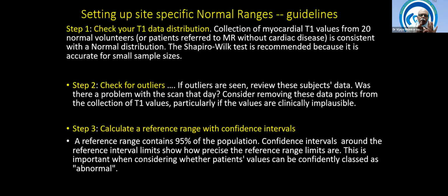How do you do it? There is one interesting article in JCMR in 2019. Good article. It says, first take 20 healthy volunteers who come for a non-cardiac ailment. Measure, whether you want global or segmental, whatever you want. Now, another important point. In healthy volunteers, if you're doing diastole, everyone you do in diastole, and in cases you do diastole. If you're doing systole, everything is systole. Again, there's variation, but it's very important. Diastole means diastole. Systole is systole only. Don't change. Volunteers or normal subjects.